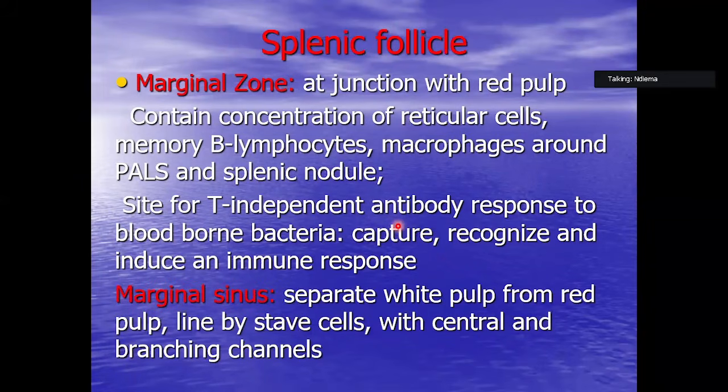At the marginal zone, we also have marginal sinuses, and marginal sinuses contain blood, and this is the zone where the cells now migrate into circulation.